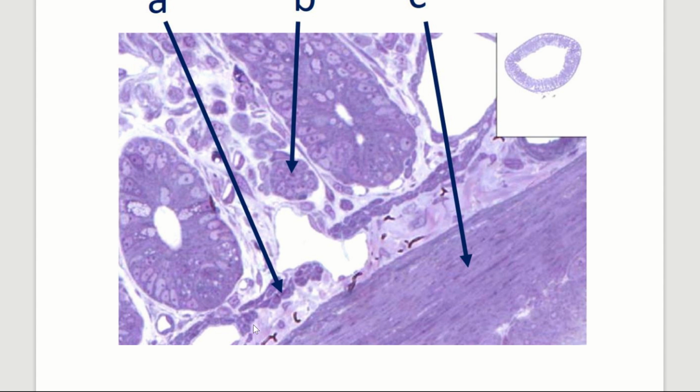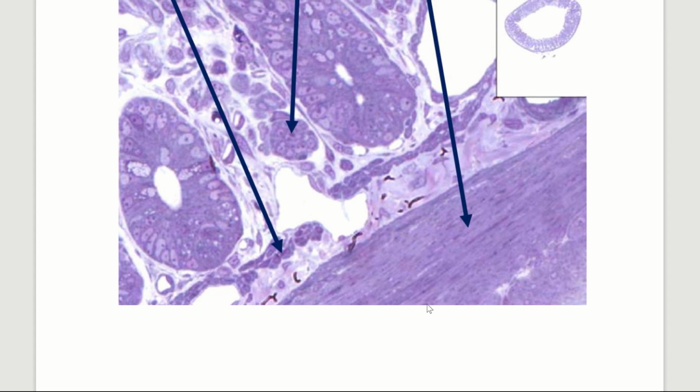So in the muscularis interna, or muscularis mucosa, and then this is going to be the muscularis externa out here, muscularis externa. And so remember, that's also smooth muscle, and that's where we've got muscle going this direction, circumferentially around the small intestine loop, and then we've got it going longitudinally, so it's going into and out of the page, so it's coming at you, and that's going to be going longitudinally down the intestinal loop. Okay, so A is smooth muscle, B is not, C is smooth muscle.